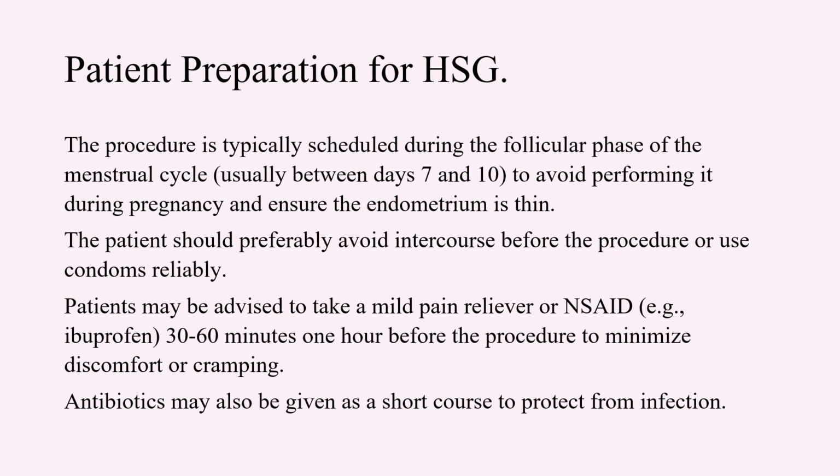Patients may be advised to take a mild pain reliever or a non-steroidal anti-inflammatory drug such as ibuprofen 30 to 60 minutes or 1 hour before the procedure. This will not take the pain away completely, but it will minimize discomfort or cramping. Antibiotics may also be given as a short course to protect from infection. This depends upon the health system within which the patient is having the procedure.